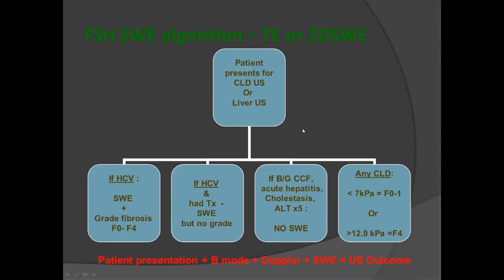And there's also another question, Marilyn, do you record the weight of the patient? No, I don't record the BMI, but if your sweet spot of 4 to 5 centimetres is less than a centimetre from the hepatic capsule, we will sometimes write that. But no, we're not collecting BMI information because the BMI doesn't always reflect if they've necessarily got increased space between the probe and the liver.